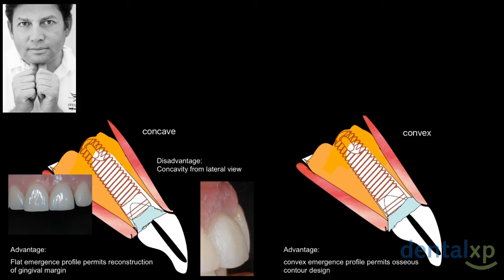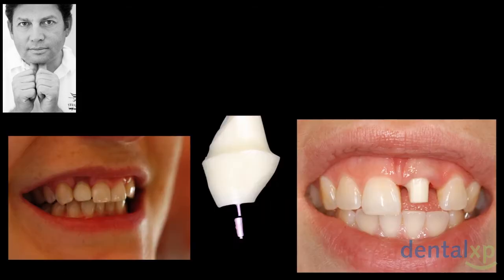We know from orthodontics, Maurice talked about it: if you have the implant moved palatal or the teeth moved palatal, the soft tissue will creep down. Now, the big advantage is it looks like a root, but we have a recession. And in the past, we used to match the implants to the root of the tooth, and that also provoked a lot of complications. So that gives us an instant recession. Here you can see darker light, concave abutment, good bone, and the soft tissue collapses.